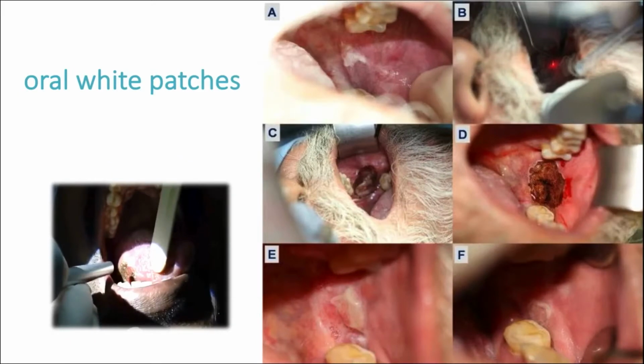The conditions considered were benign lesion, leukoplakia, and malignant lesion, with no intraoperative complication. And each patient made an uneventful recovery when compared with other forms of surgery. CO2 laser has a certain advantage for both the surgeon and the patient in the treatment of oral soft tissue pathology.